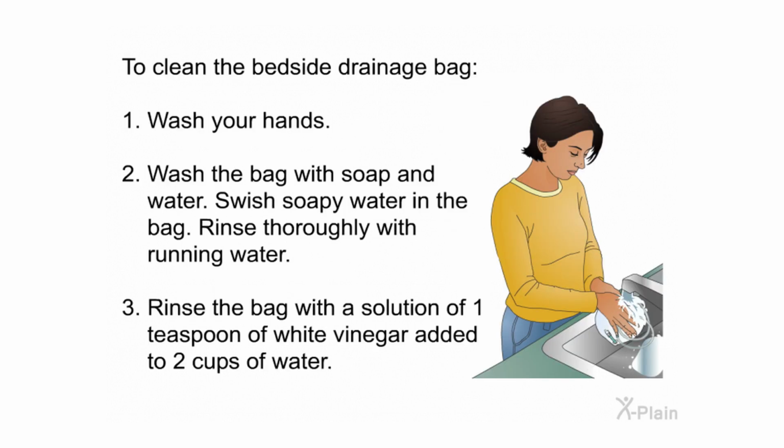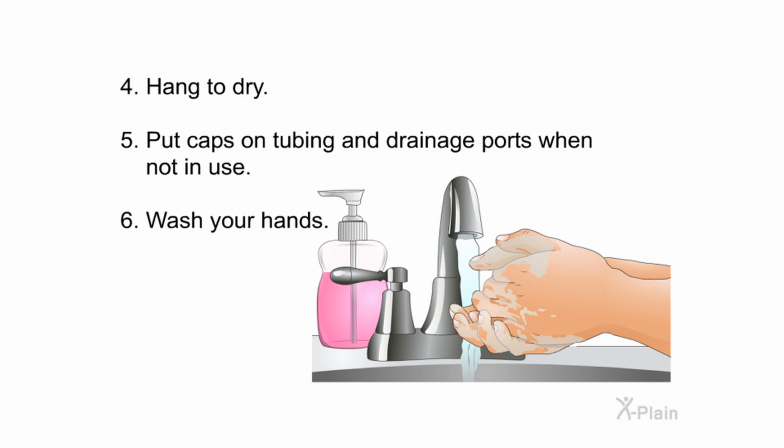To clean the bedside drainage bag: 1. Wash your hands. 2. Wash the bag with soap and water. Swish soapy water in the bag. Rinse thoroughly with running water. 3. Rinse the bag with a solution of 1 teaspoon of white vinegar added to 2 cups of water. 4. Hang to dry. 5. Put caps on tubing and drainage ports when not in use. 6. Wash your hands.